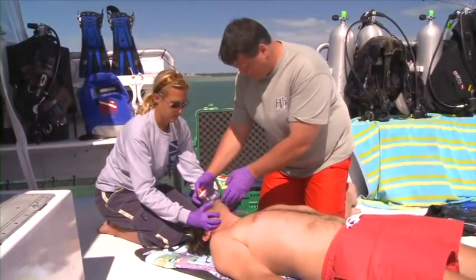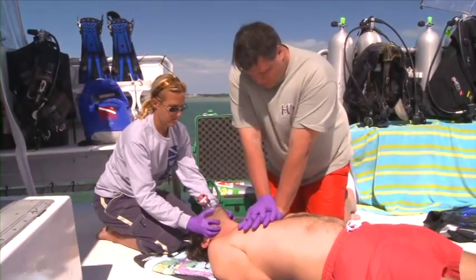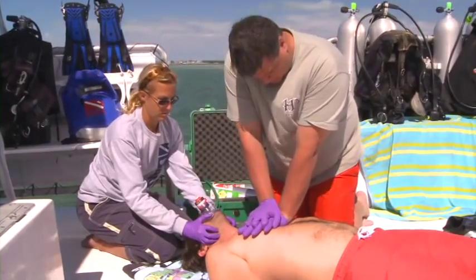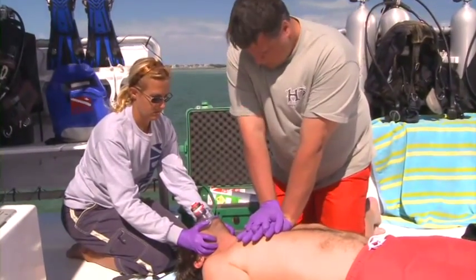Monitor the patient's skin color, especially around the lips and mouth, for effectiveness. When performing CPR, provide continuous cycles of 30 compressions and two ventilations. Allow for full exhalation of the first ventilation before providing the second one.